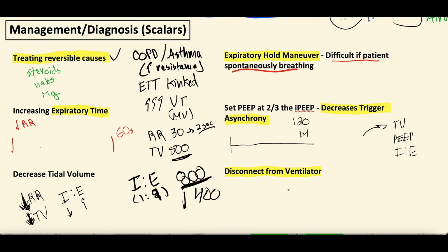Because it's another thing I probably should mention as diagnostic maneuvers. AutoPEEP increases plateau pressure. All right, so plateau pressure, for those of you that don't know, is the inspiratory pressure. So if you push a breath in, make the patient hold it, the ventilator then just detects the amount of pressure there. And you can guess that AutoPEEP would increase the inspiratory pressure, right? Because you have all this pressure built up in the lungs that if you push another breath in and then pause, you don't let any volume leave the lungs. It's an inspiratory hold. The AutoPEEP will be all that air that was already in the lung, in addition to the air you pushed in the lung during the inspiratory hold. So that's going to increase the plateau pressure.